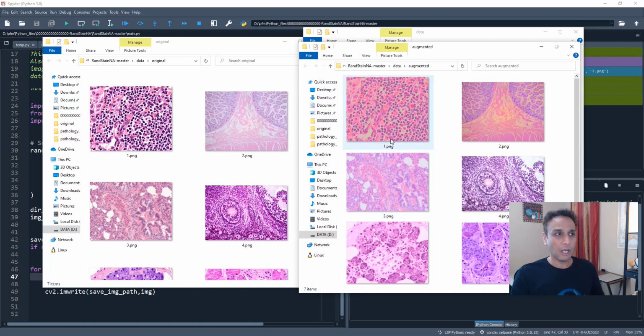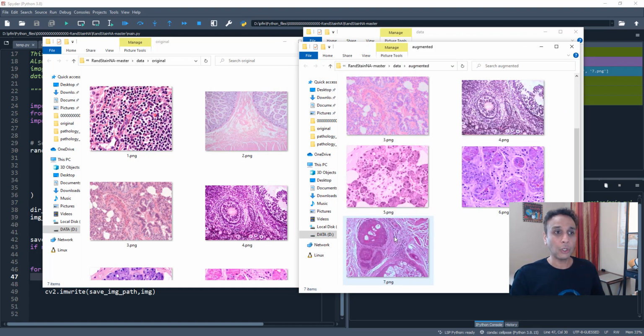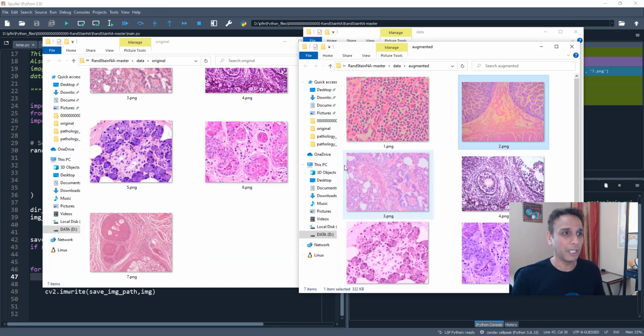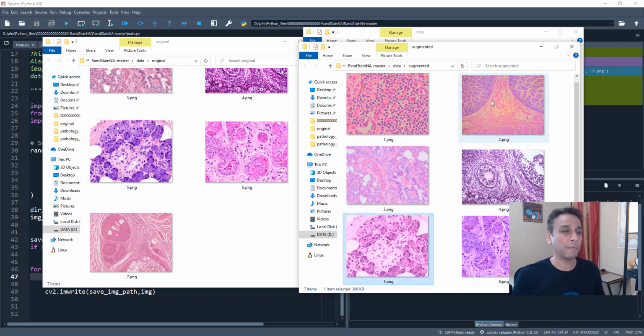And now these augmented images look reasonable. These really help us in generalizing our model to the input data. Maybe the first two have a bit of a yellow shade, but look at all the other ones. And this yellow shade is probably coming from our train images, and you can narrow down this space even more by choosing appropriate train images.